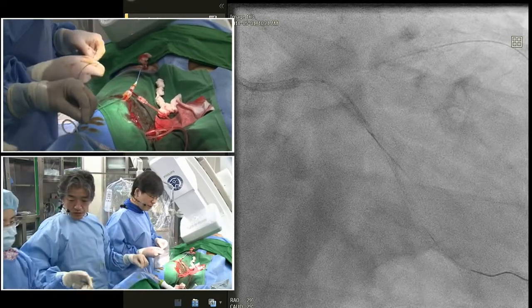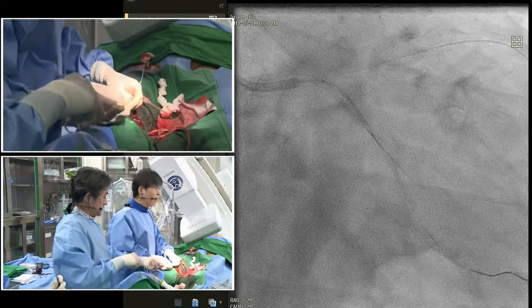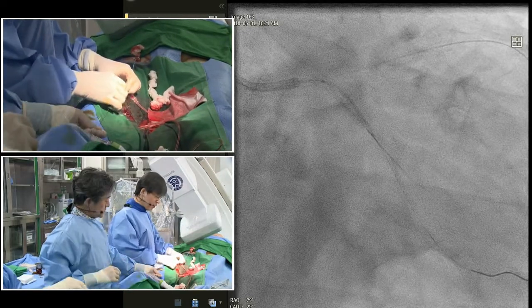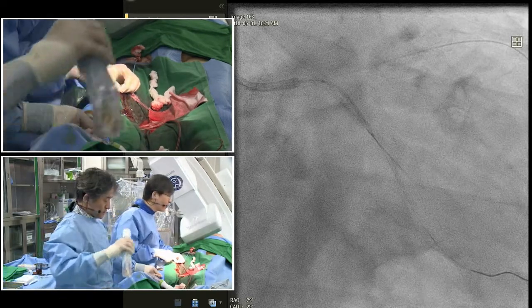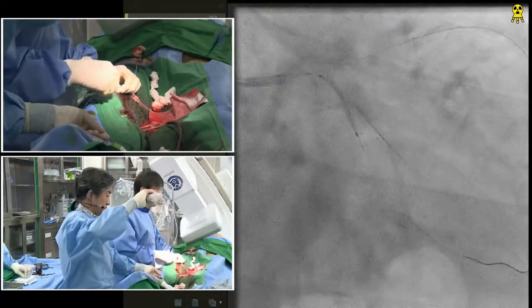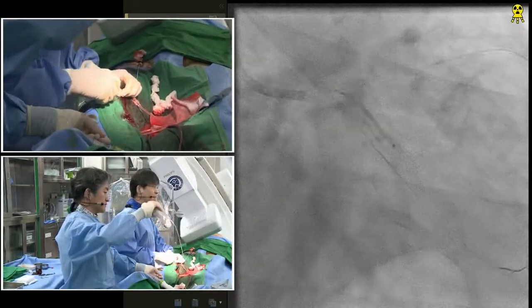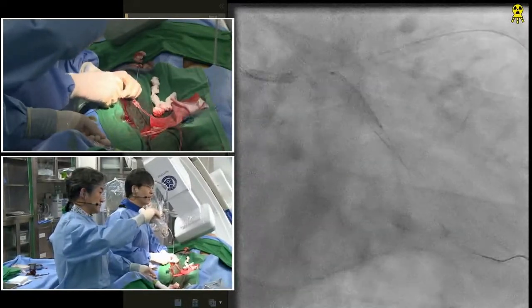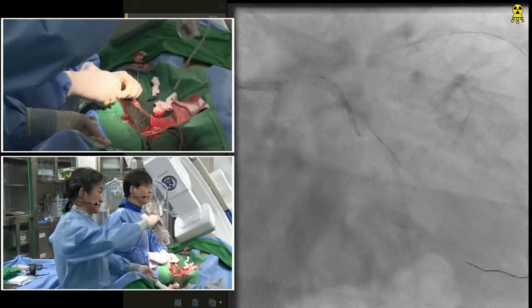Dr. Hong, could you explain your strategy of two-stent technique now? I'm trying to do the crushing stent technique. I'm so happy to hear the voice from Professor Sung in this conference. So is this a DK crush or is this a classic crush? Mini crush. Because this case is image guided, I did try to fix all of it image guided.